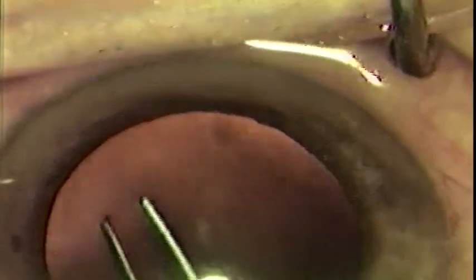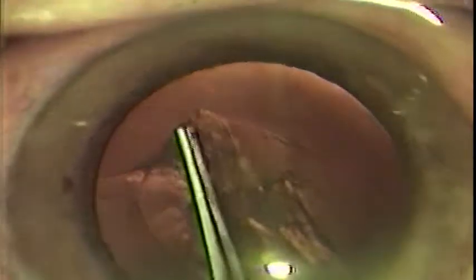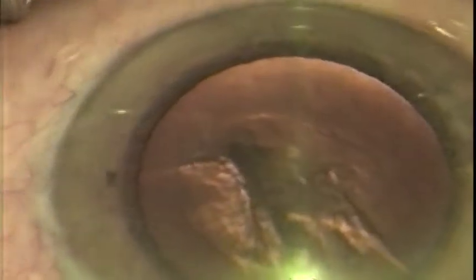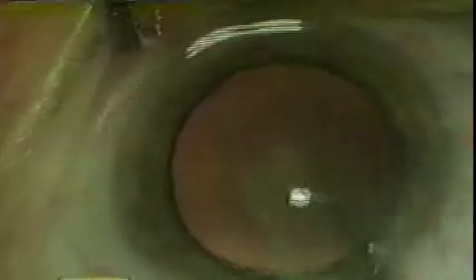Here I describe a new capsular rexis forceps that can perform each of these maneuvers with a single instrument. The unique feature of these forceps is its thin, round, uniform diameter blades designed to minimize wound gape. Its jaws are 8 millimeters from angle to tip, placing the tips at closer proximity to the center axis of rotation. The tips are tapered to more closely resemble that of a cystotome, allowing the capsule to be grasped and opened in one maneuver. The round handle enables the instrument to be used with a rotating motion of the thumb and index finger rather than movement of the entire hand and wrist, creating better sensitivity and control for the surgeon.